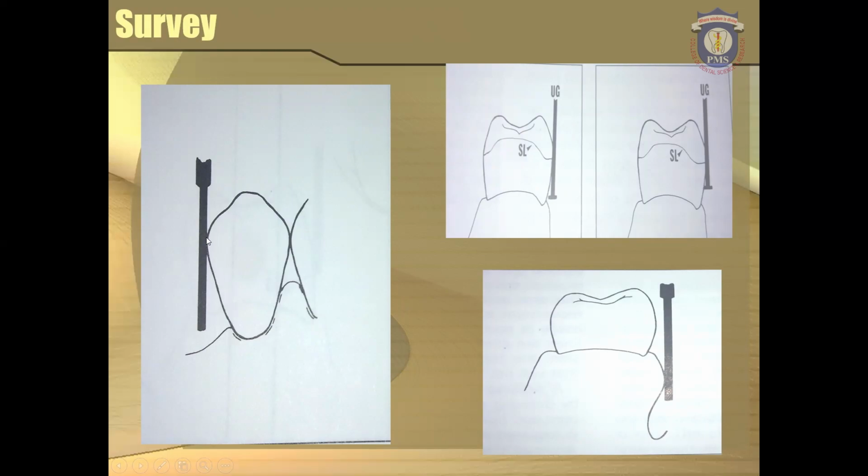Okay, so for all the teeth in a cast, there will be a prominent portion, there will be undercuts. So these undercuts need to be identified for placement of the retentive terminal of the clasp. Okay, so we'll see each in detail. So I wanted to show you how the surveying tools will pass along the surface of the tooth. That is the representation here.